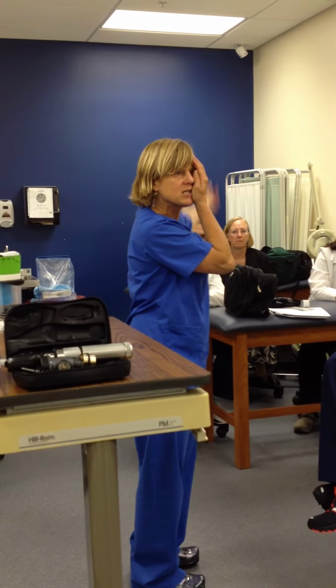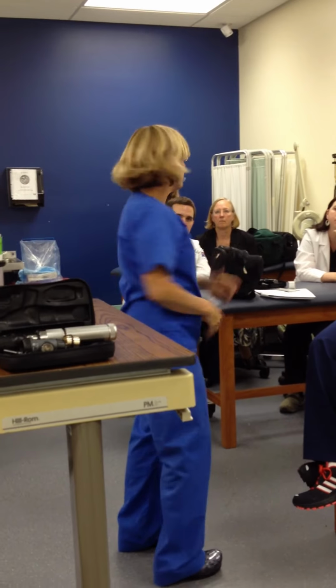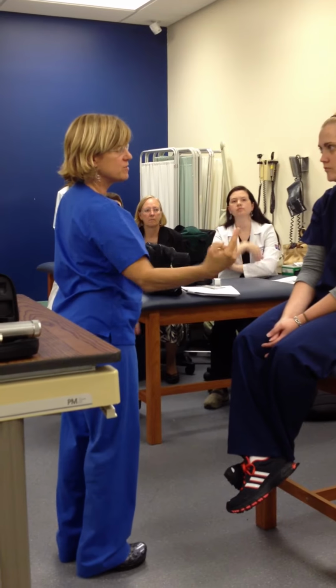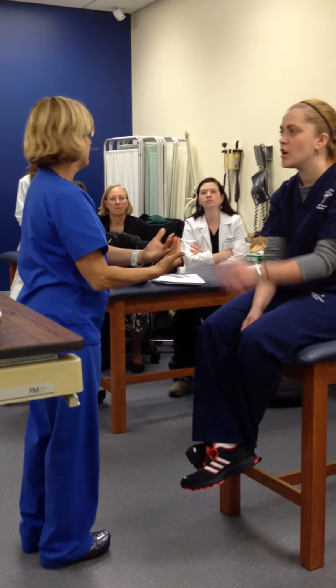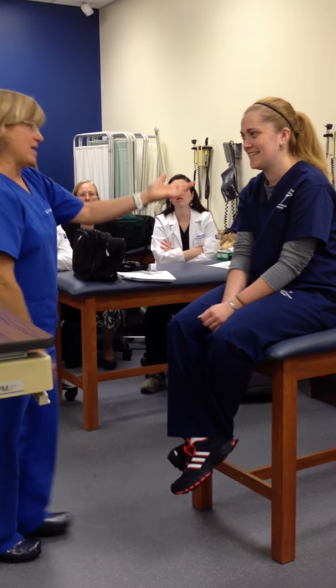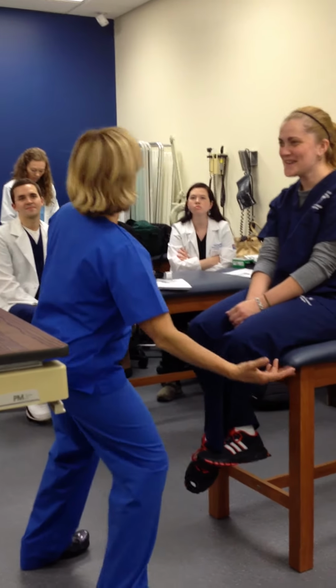If I switch, then the patient switches because they're watching me. So it's kind of weird. So just make sure your elbows and arms are not going in front of them, just the fingers. And stay right on that plane. So if they can still see you like down here, you have to be perfect. Like, okay. No, I can't see it anymore. And you could probably go really thin.